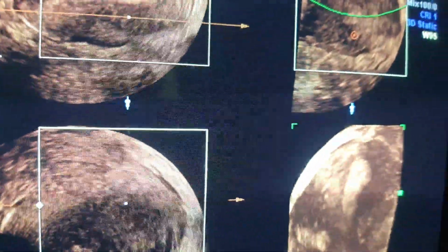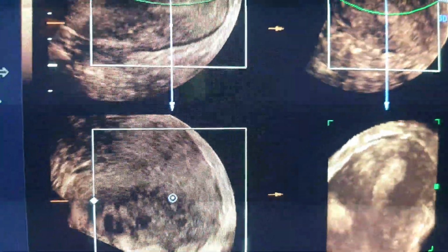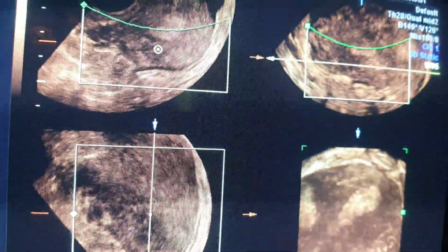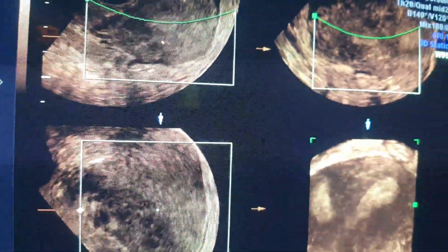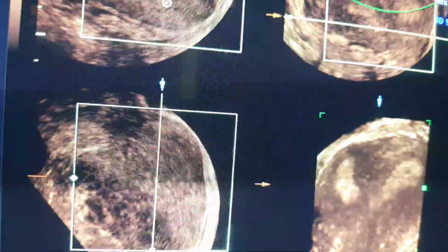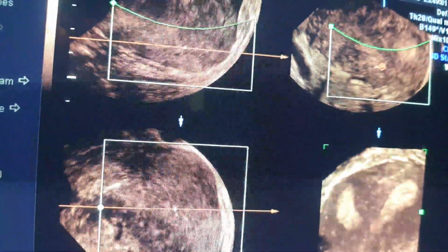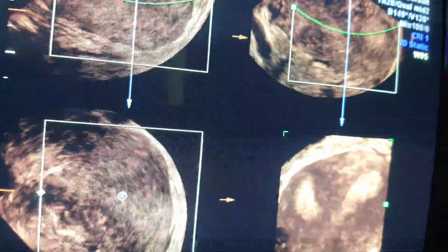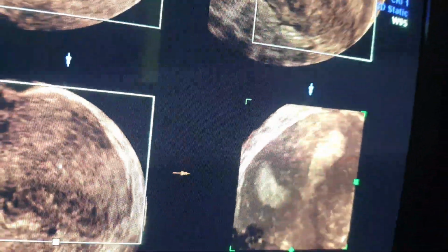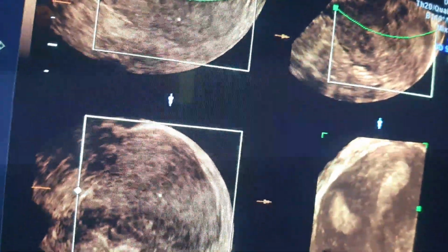But actually, when we are still working on this plane and we move it from side to side and use the buttons of the analysis here, until we reach this picture I need. Okay, so this is the picture which you can see now, changed completely. As you can see here, I just rotated the picture until I found that there is something related to that endometrium. And of course here the picture completely changed.